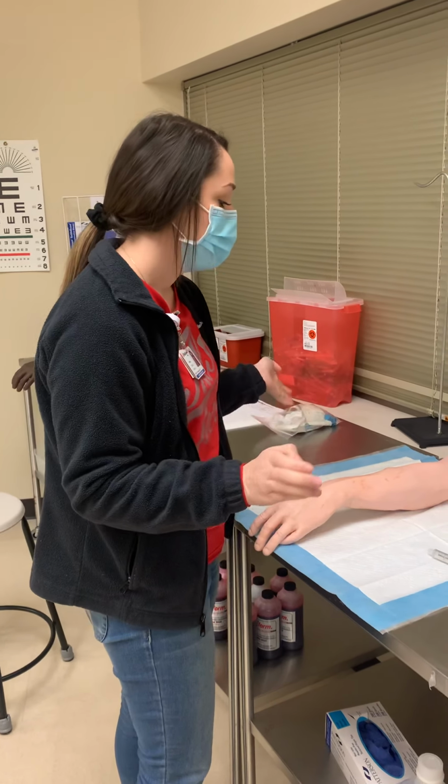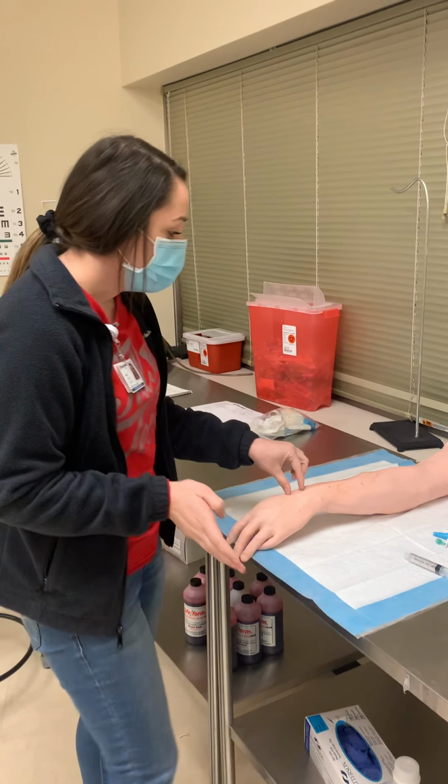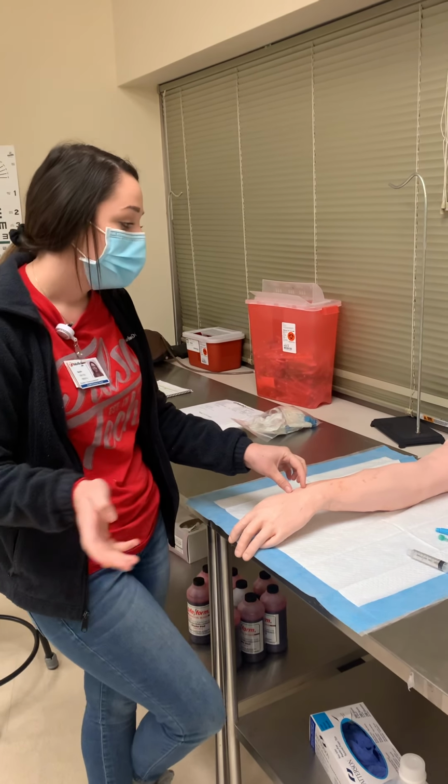Hi, my name is Baylie. I'll be inserting an IV in you today. Do you have any questions? Can you tell me your name and date of birth? Okay, and do you have any allergies?